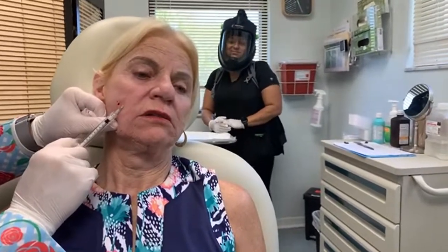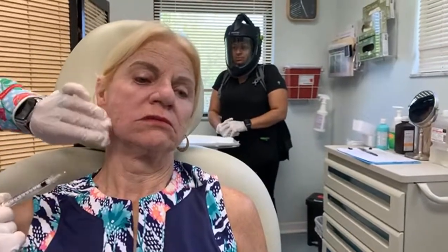Everything's looking good. How are you feeling, Donna? Great. You feel big pinch, little pinch, not too bad there? Not bad at all. So again, I'm just trying to fill out these little creases, thicken the skin. Little pinch there. This is an intradermal injection.